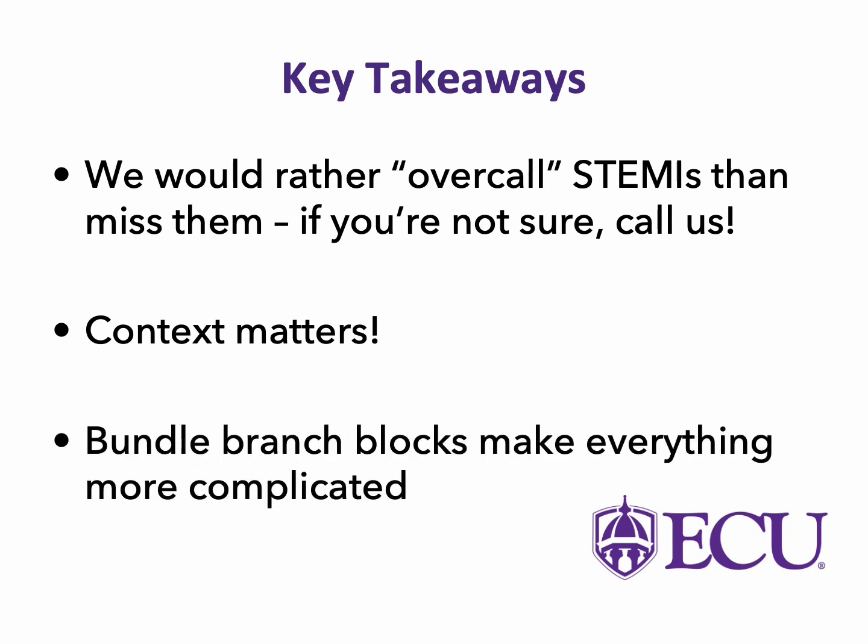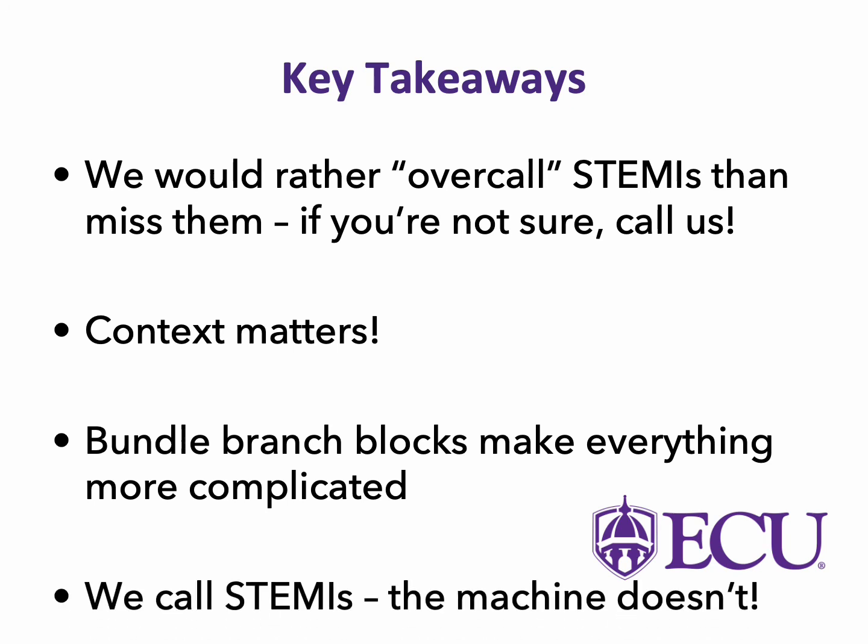Bundle branch blocks, like I said, make everything more complicated, but hopefully we broke that down a little bit today and made it a little bit easier to digest so you feel more confident calling that in the field. And with that, again, we call STEMIs. The machine doesn't. Just because the machine reads STEMI does not mean that you have to call a STEMI in the field. Use your judgment at the end of the day. That's what you're trained for in order to make that call.